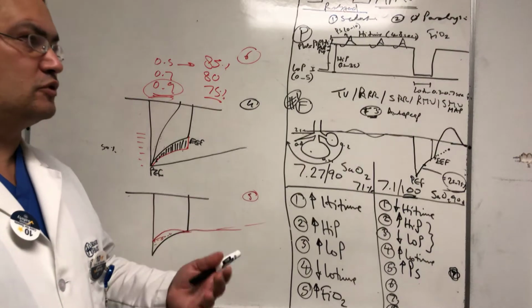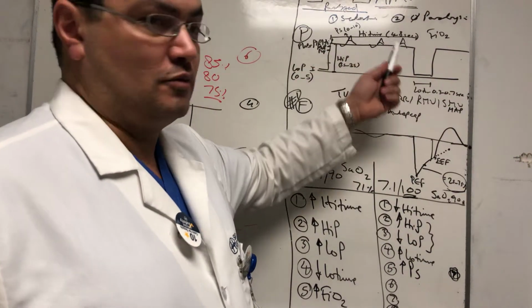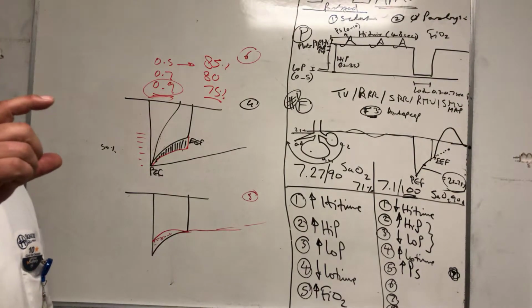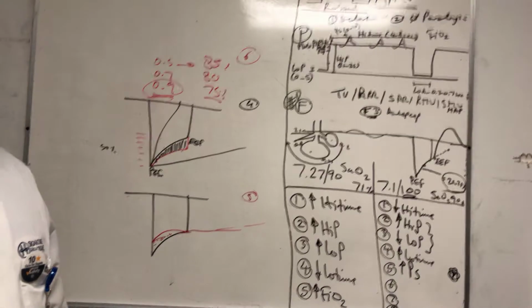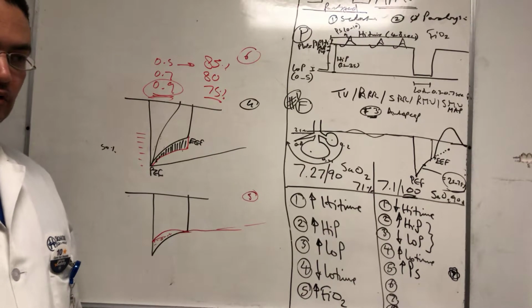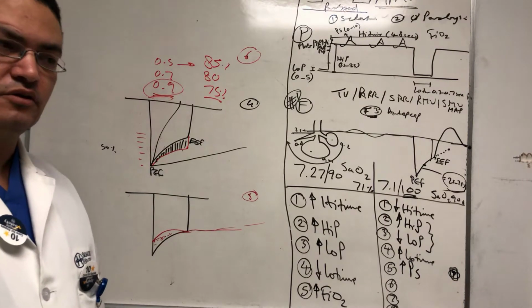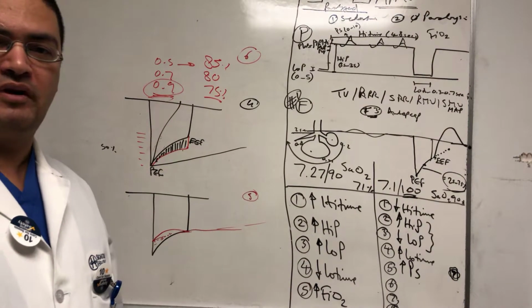If you have negative pressure ventilation, which this mode depends on, these breaths, although they look negligible, are actually very valuable. 100 cc or 150 cc of a spontaneous breath is much better than a 300 machine breath, because it's well distributed, relatively better distributed than the other modes, and uniformly distributed. That's why spontaneous breathing is good. And that's why pressure support is number 5.